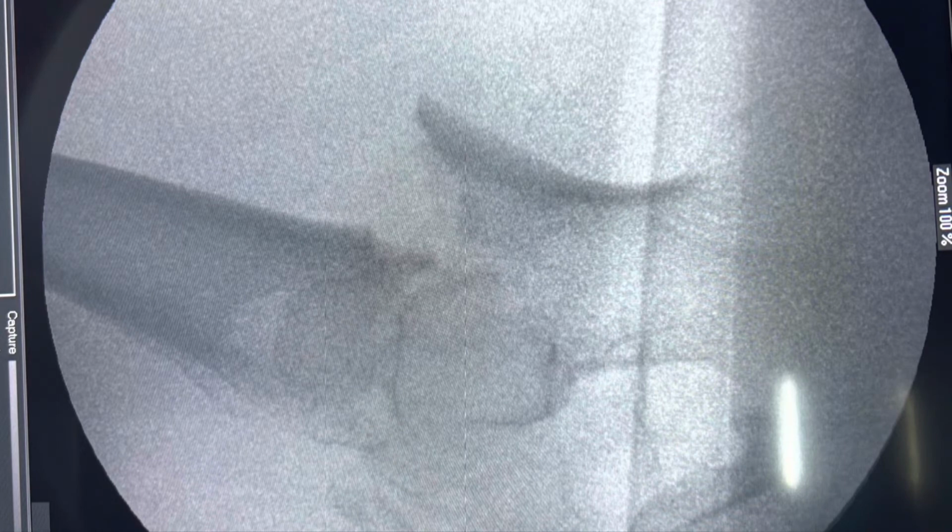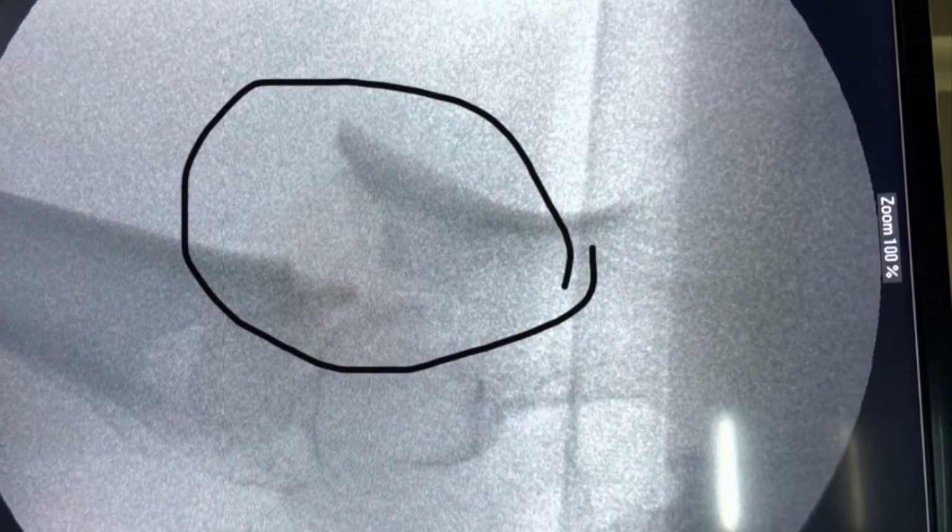One is posterior sagging of the distal fragment at the fracture site, and another is external rotation displacement of the proximal fragment. That posterior sagging is due to upward lifting of the distal end of the femur by adductors. This posterior sagging can be corrected by anterior lifting of the femur at the fracture site. Here is the bony spike.